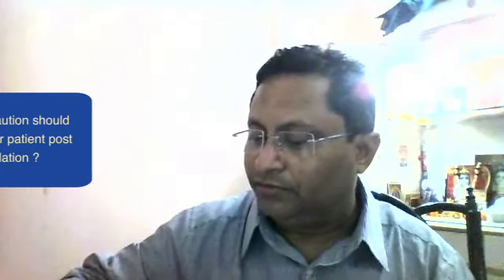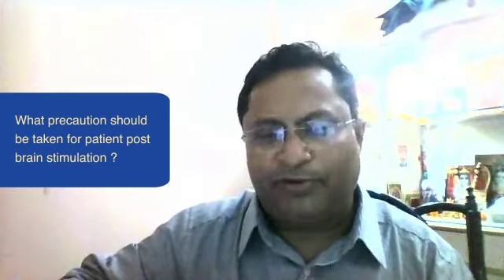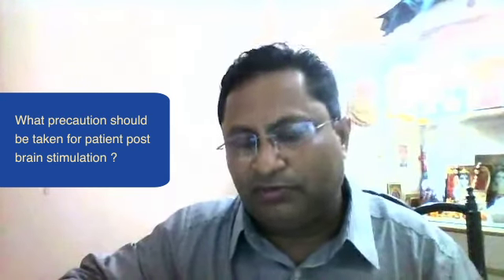Next question is, what precautions should be taken after deep brain stimulation? Nothing specific. We have to do some dressing for the wounds, the pacemaker wound and the one in the head, every alternate day. No other specific precautions. We give some medicine for the pain, some antibiotic for a few days, and the previous medicines also go on for some time.